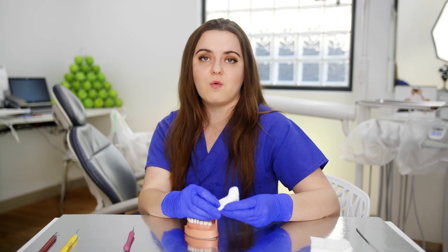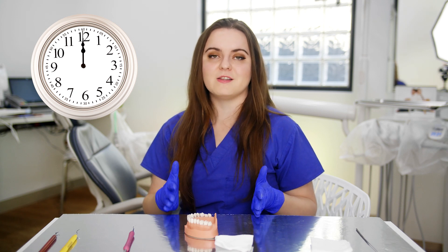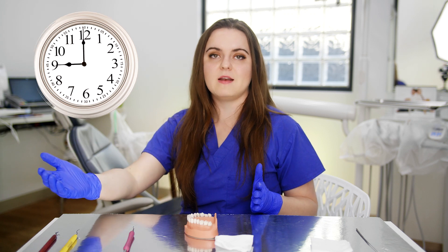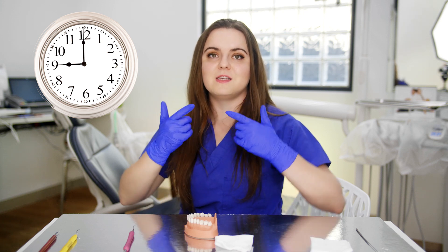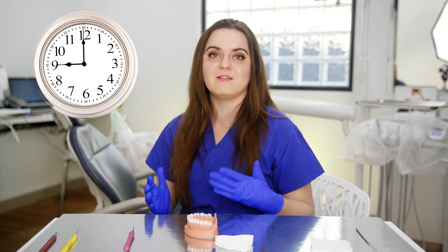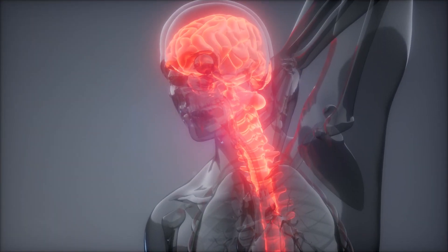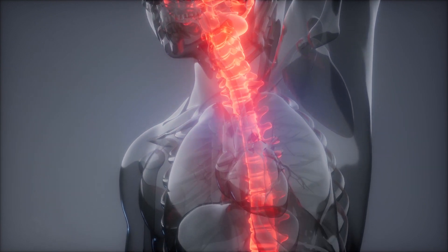When you do restorative work, you quite often sit straight behind the patient at 12 o'clock. But with removing calculus, you do want to be moving around the patient all the way from 8 and 9 o'clock all the way around. Because when you're debriding, you're working on so many different surfaces from posterior to anterior. So you need to be moving around in order to prevent back and neck injuries. Guys, super important — move around.